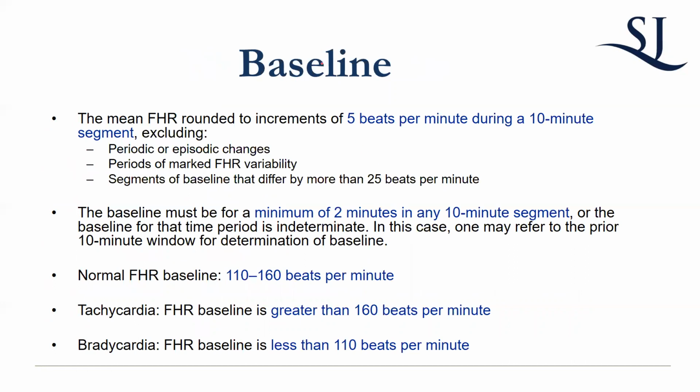But so for a baseline, and if you have a question, interrupt or raise your hand, okay? A baseline fetal heart rate, like I said, is rounded in increments of 5. You're not going to say, all right, fetal heart rate's 132, because it's all visual estimates, right? These things are measured for 2 minutes in a 10-minute segment, okay? That's why I always tell the residents, you don't watch a pot boil and you don't watch a fetal heart rate unfold, because you need 10 minutes, right? If you just look at the little spike, it doesn't tell you anything, okay?